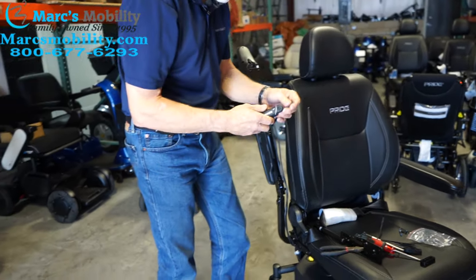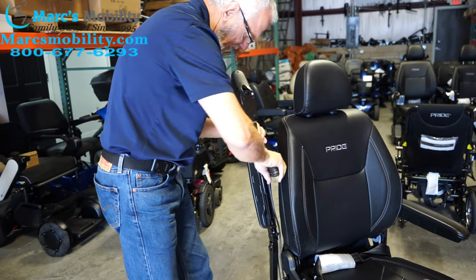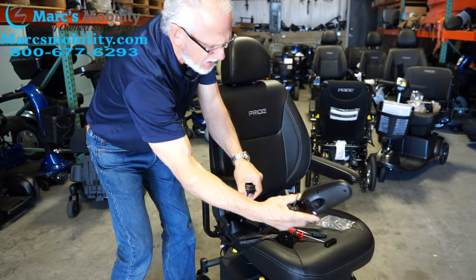Then you'll take your Allen wrench, put it in here, and unscrew that so that the arm comes out. You may have to lower the arm down because it won't come out otherwise — lower it down and then the arm will come out.